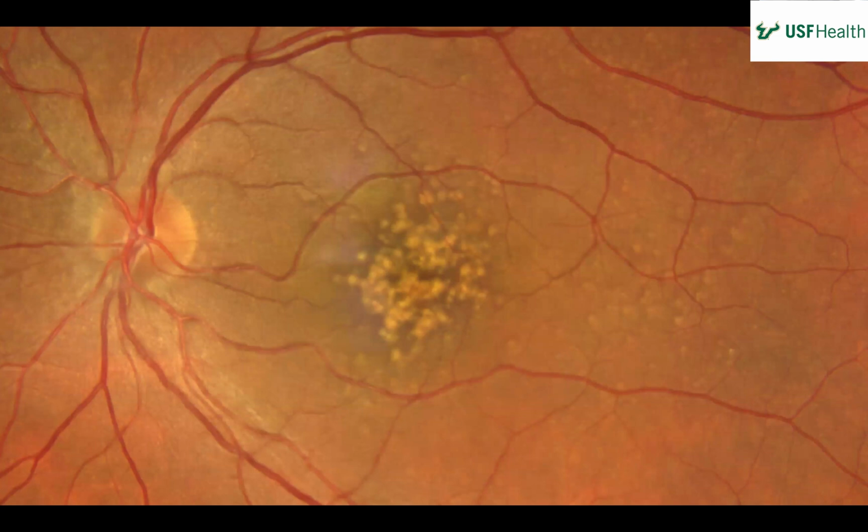Left eye fundus photo, media clear, nerve looks pink, sharp, flat, vessels look pretty good, and then your attention is once again drawn to these yellowish deposits in the center around the macula, and you do have an area of hyperpigmentation in the background. I can't tell if that's just by contrast. Of course they are right in the macula and the fovea, but the stippling does extend a little bit temporally and superiorly.